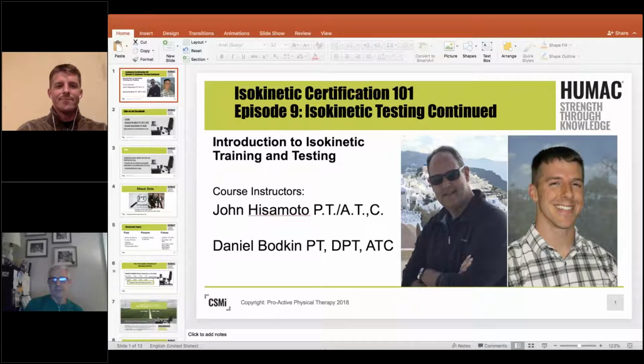This episode's kind of a special treat. It's the result of requests that we had from last month's episode in regards to how do we do an isokinetic test or an interrupted stroke test from put my patient in to printed report. Daniel was kind enough to come to Boston, and we grabbed a couple other people to join us at CSMI HQ. We filmed doing the interrupted stroke test and also a traditional isokinetic concentric test. And then he went to town, edited it up.